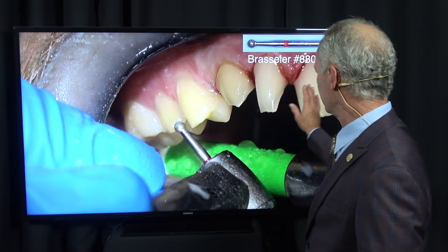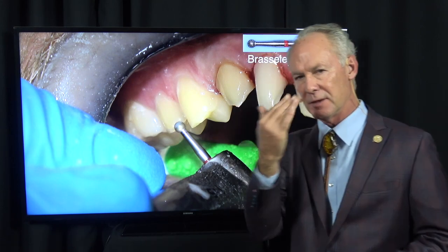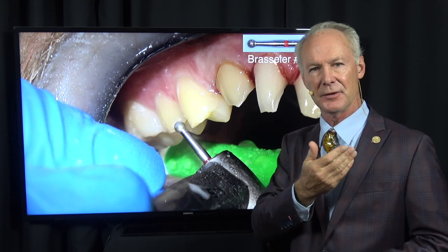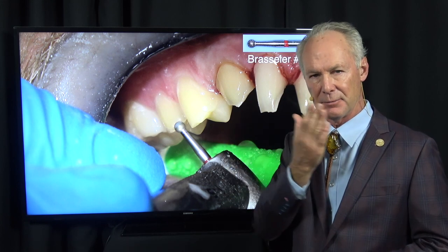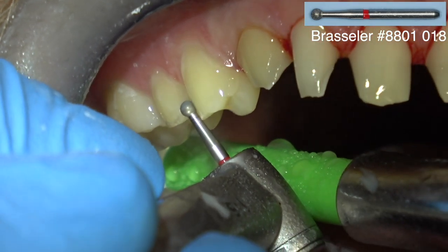Now, what if one of these teeth, say the central incisor, was facial verted? It was out like this. If it's not to the point that the person needs orthodontics prior to veneers, you're going to cut that back into the arch alignment and then do the veneer preparation. So cutting it into the arch alignment doesn't count as veneer preparation. You're not prepping it for a veneer until it's back into the arch alignment. In this case, we really didn't have to do that.